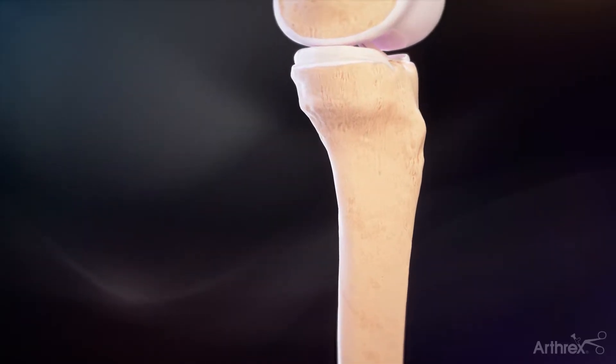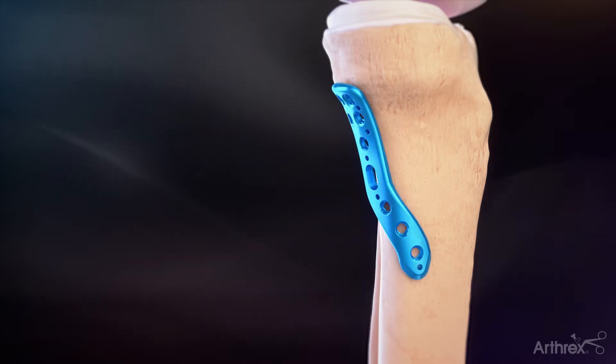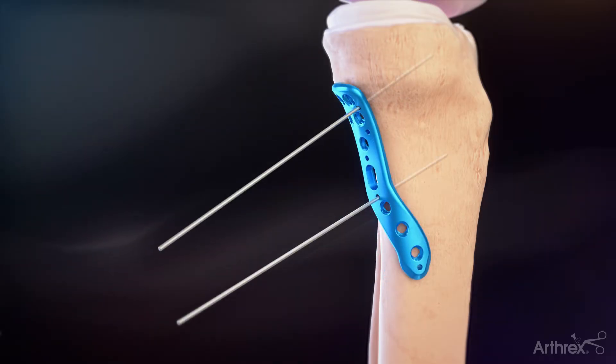Select the desired length for the posteromedial plate. The plate is designed to sit distal to the insertion of the semimembranosus tendon. Pin the plate to the bone with 1.5 mm non-threaded guide pins.